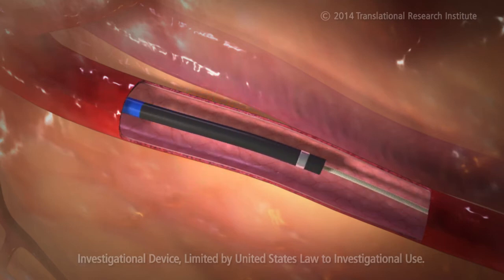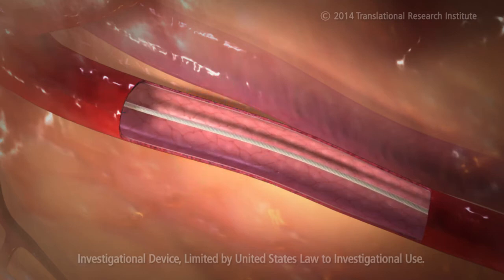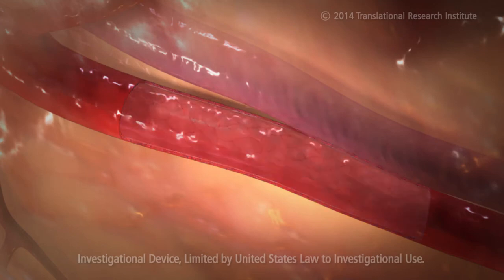The balloon is deflated, the catheter is retrieved, and the guide wire and guide catheter are withdrawn.